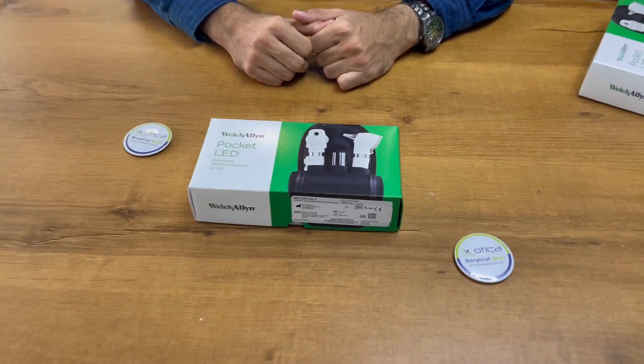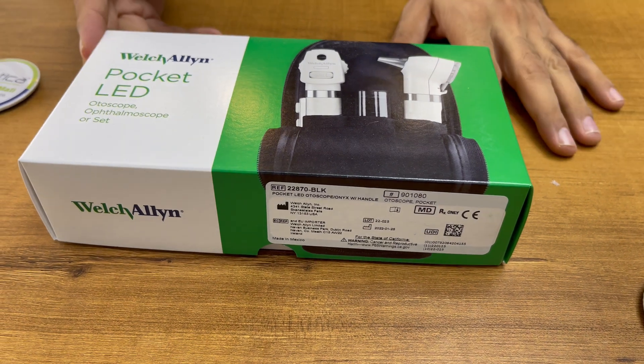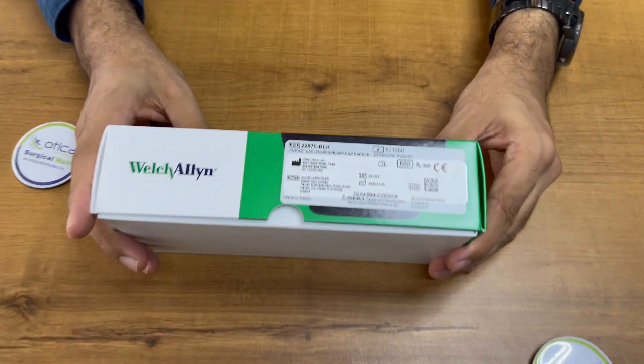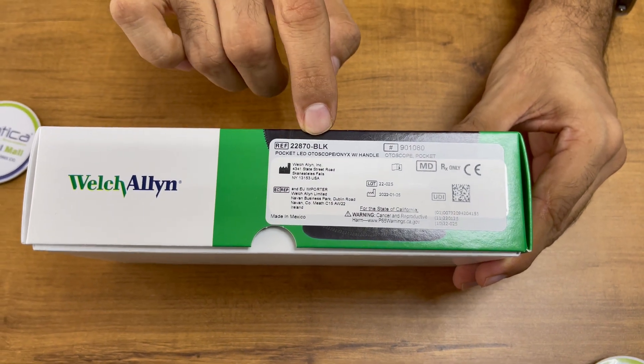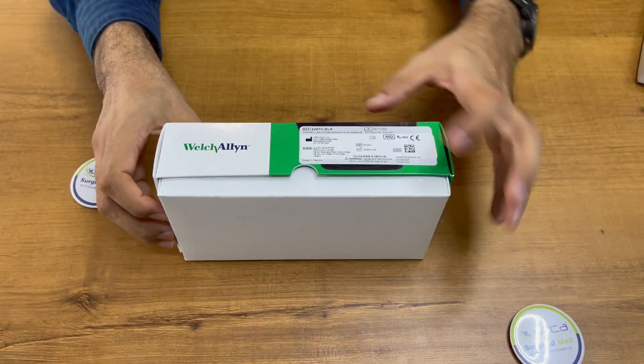Hello friends, welcome to Otikam Editronics company. Today we are going to demonstrate an unboxing of the pocket LED otoscope. The model number of this pocket otoscope is 22870. This is a very good machine that comes from USA and is made in Mexico.